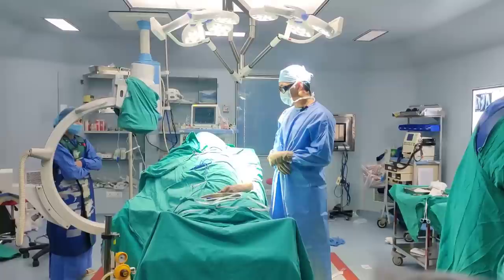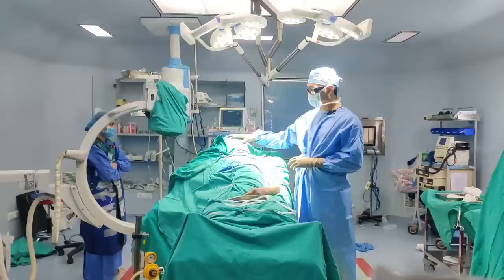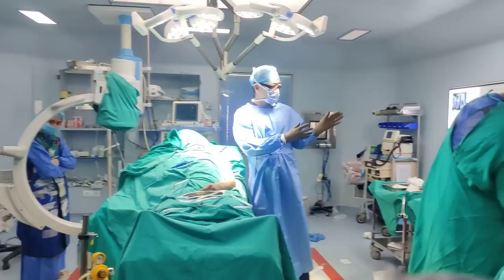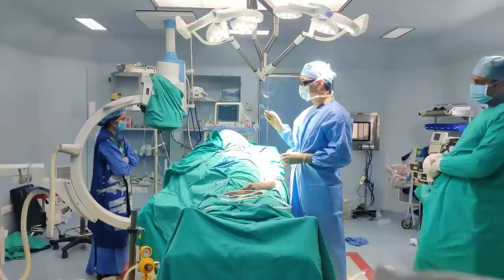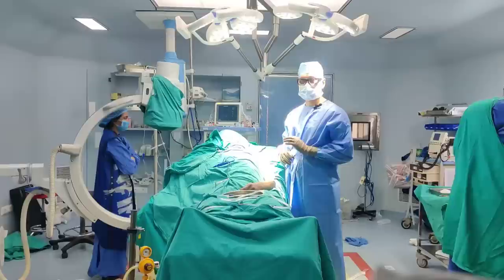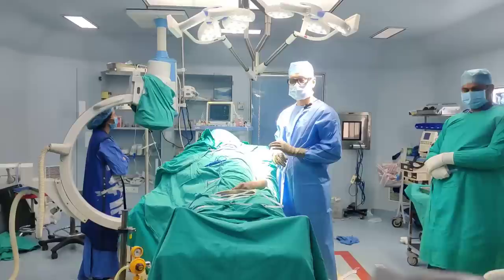This is our setup position. We do this in beach chair position. You need to have a shoulder table or reverse the table to get into this position. Get your anesthetist to put the tube and then turn the head to the opposite side so that you have good access right from the sternal notch onto the lateral end of the clavicle. My trolley is on my left-hand side and my C-arm screen is right in front. I am not going to cover C-arm positioning here as I have already uploaded a video explaining how to get a perfect circle of the coracoid. So we will move on to the skin incision.